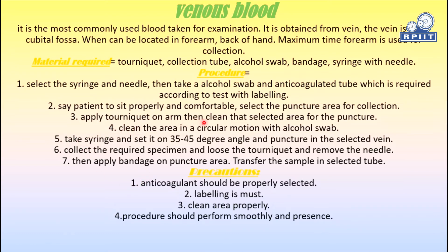Ask the patient to sit properly and comfortably, then select the puncture area for collection. Apply the tourniquet on the arm, then clean the selected puncture area using an alcohol swab. The alcohol swab should be applied properly to clean the area before puncture.